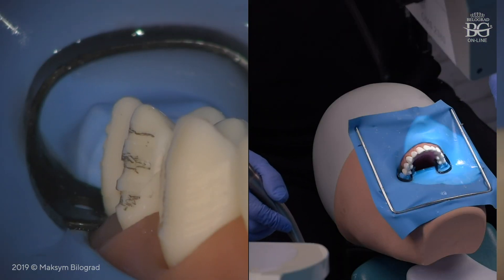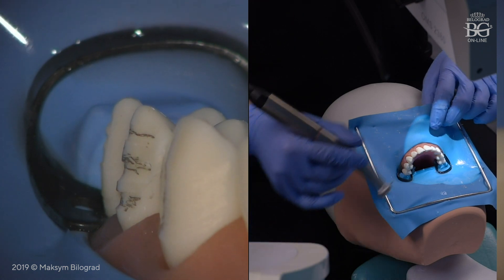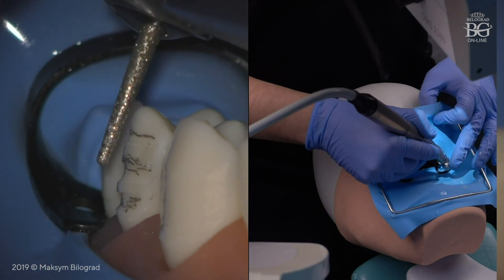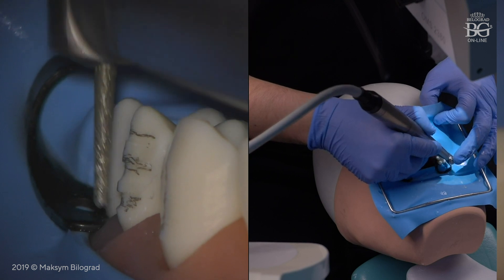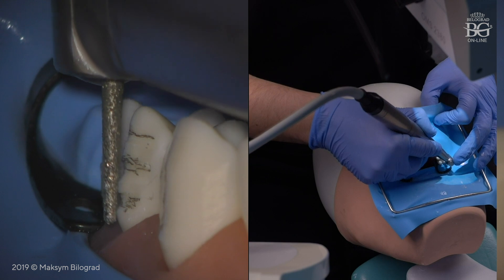This One Minute Dental Series is dedicated to two-plane preparation that is used for crown preparation because of the vertical pathway of insertion. It is very important to control your burr when you prep planes. In this case, we have to prep two planes: the incisal plane and the second plane.